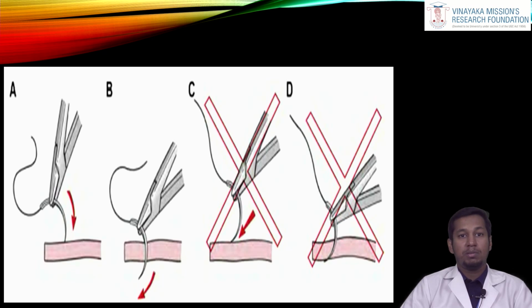The next variety of suture is the figure of 8 suture, which is most commonly used for extraction socket closure as well as for adaptation of the gingival papilla around the tooth. It is used especially in the case of the mandibular first molar or maxillary first molar, where the buccal and lingual flaps have been raised very widely due to the surgical approach.